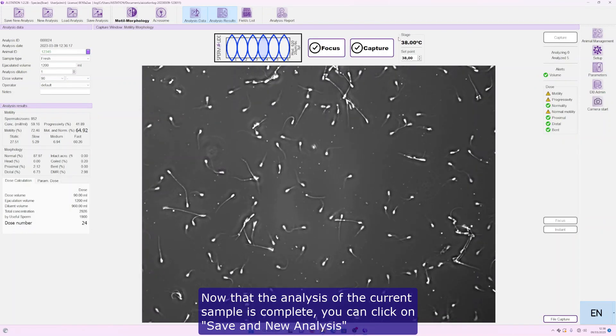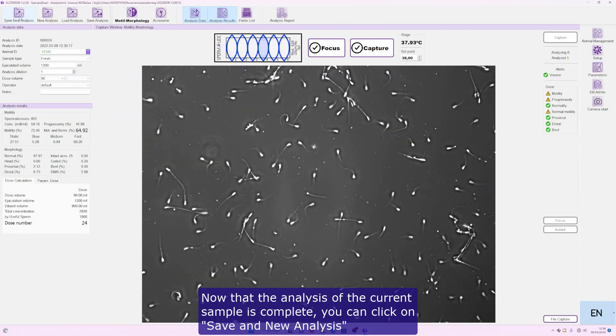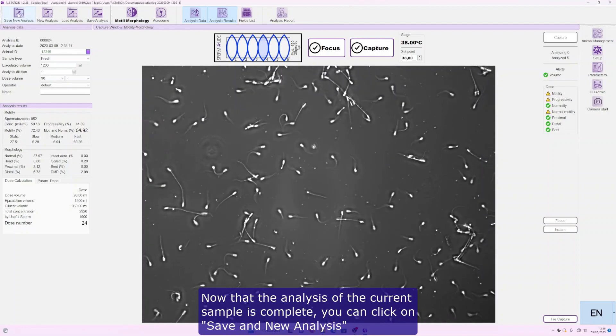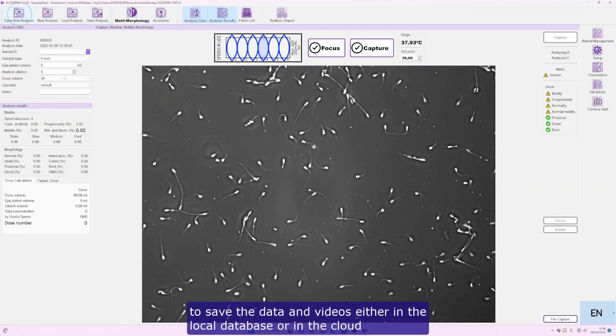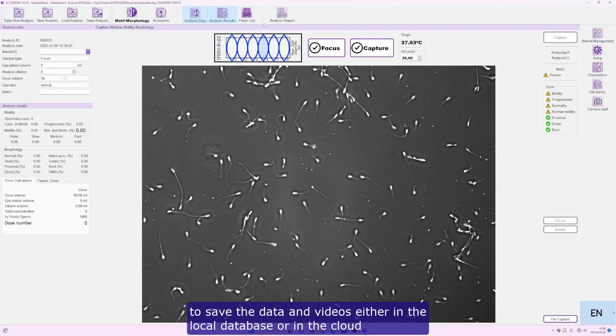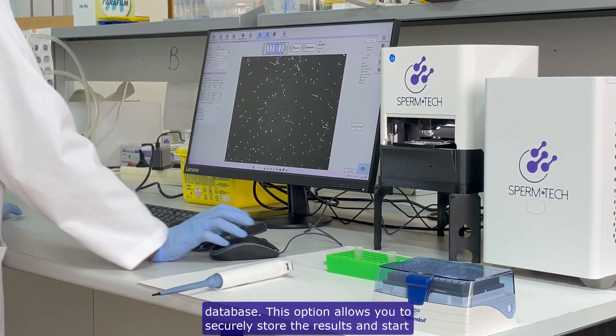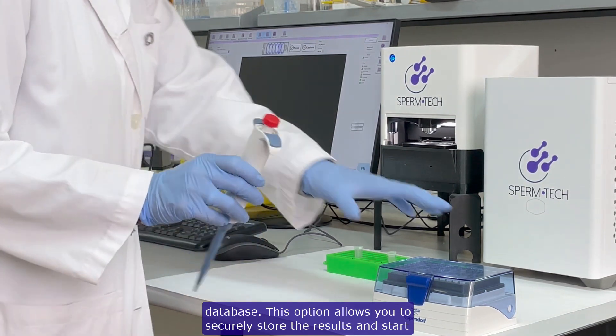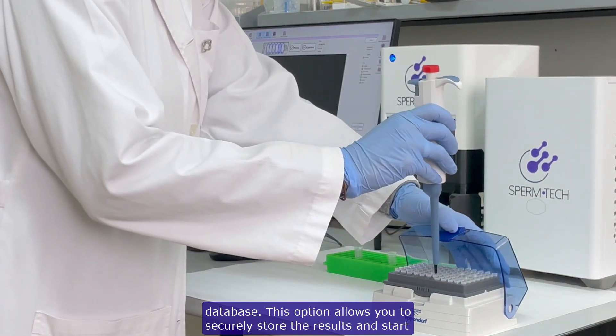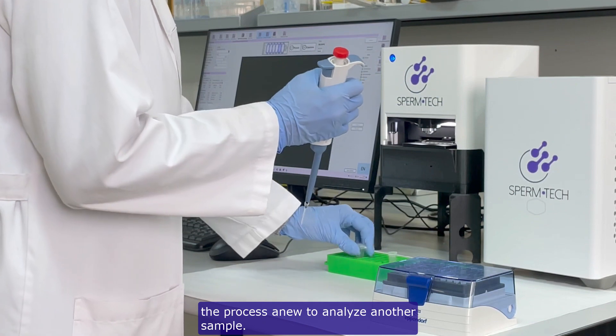Now that the analysis of the current sample is complete, you can click on Save and New Analysis to save the data and videos either in the local database or in the cloud database. This option allows you to securely store the results and start the process anew to analyze another sample.